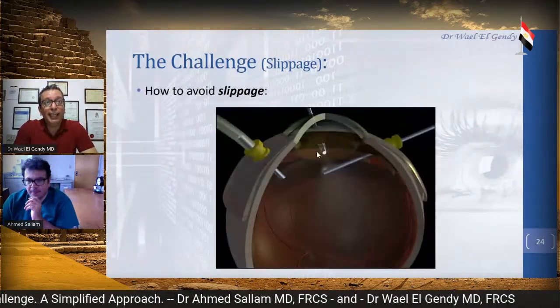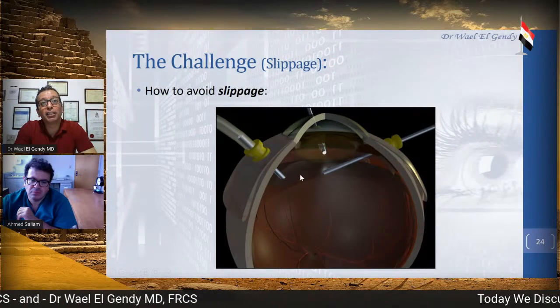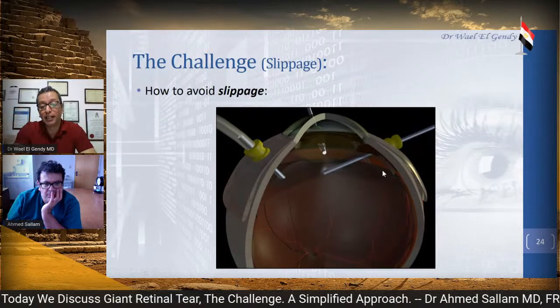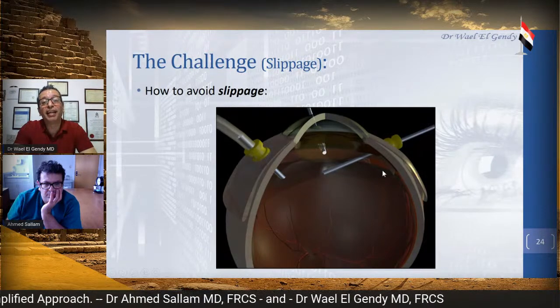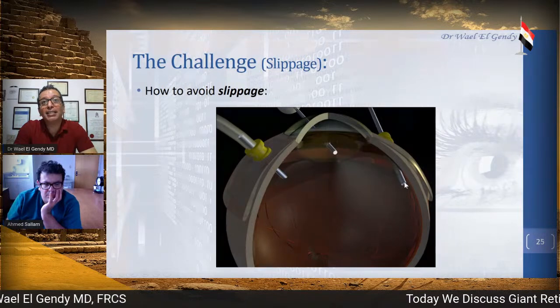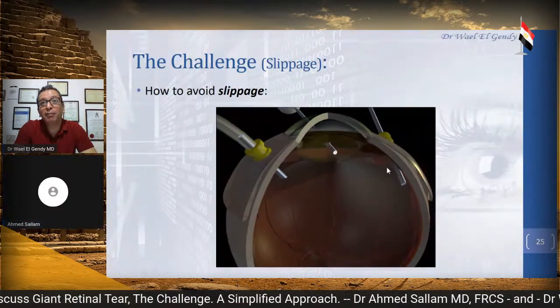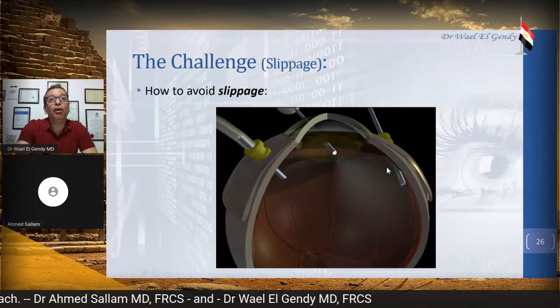So here in this image, it shows us as we do the air exchange, you see the perfluorocarbon at the periphery. The fluid meniscus would look like a dark ring because the perfluorocarbon is very hydrophobic. And if you go at the meniscus and start aspirating, once you get rid of the fluid, this ring disappears, as you can see here. Here we have the black ring, obvious, and now it disappears when the fluid goes away. And then you go all around the eye.